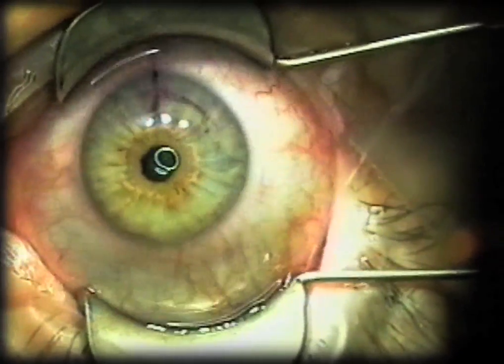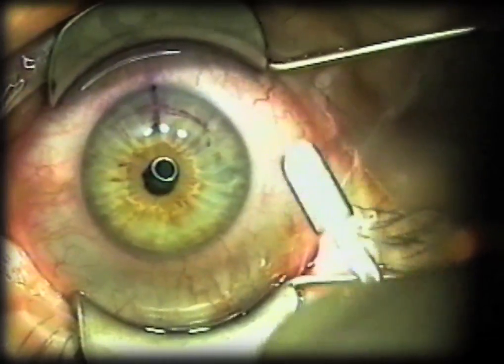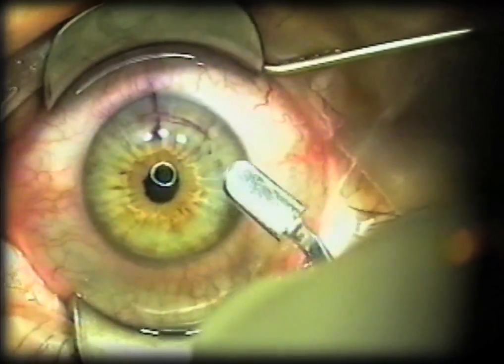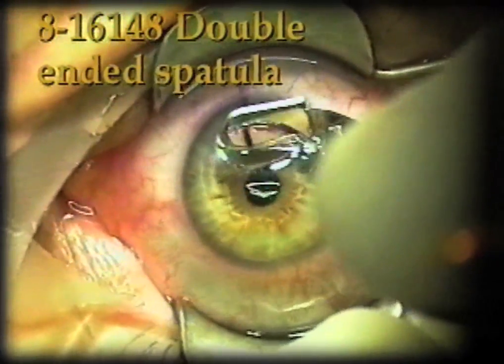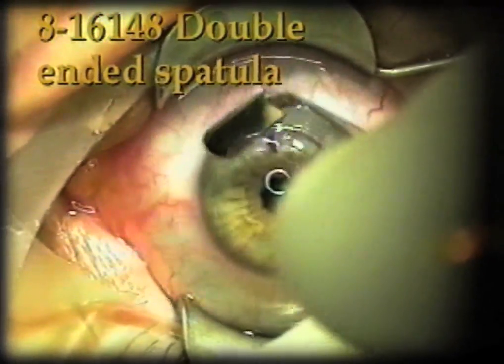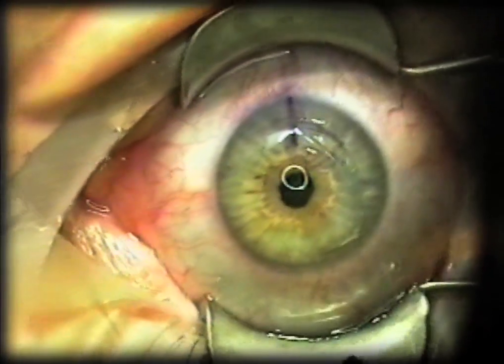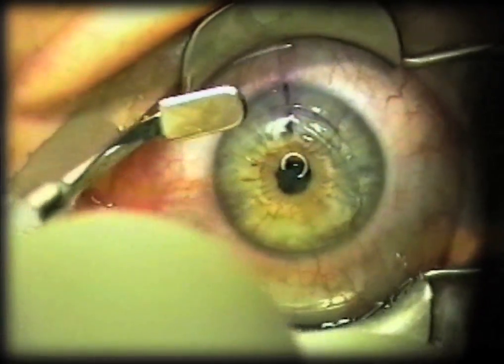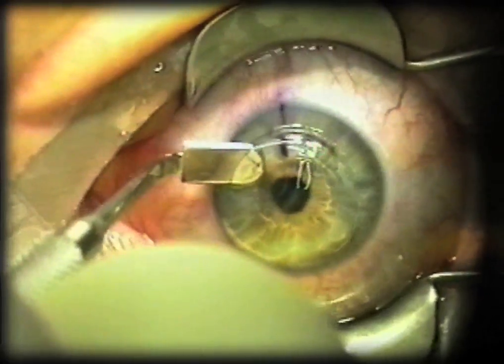This happens to be an enhancement case. At the slit lamp preoperatively, I've opened up about one clock hour with the jeweler's forcep. This is the broad blade end of the spatula, and this blade is semi-sharp. It's very helpful in cleaving the epithelium as cleanly as possible when lifting the flap for these enhancement cases.